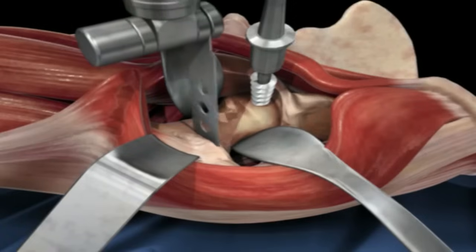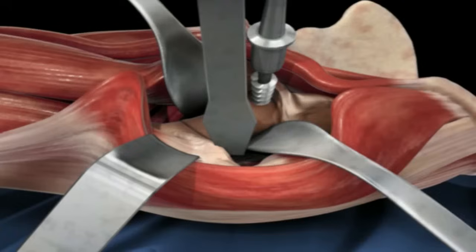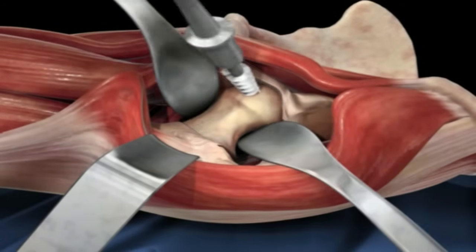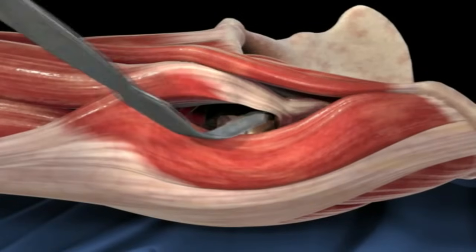Once the cut is complete, a tool is inserted to help pry the bone apart and the head and neck segment can be removed and discarded. The next step is to expose the acetabulum, or socket, with retractors.